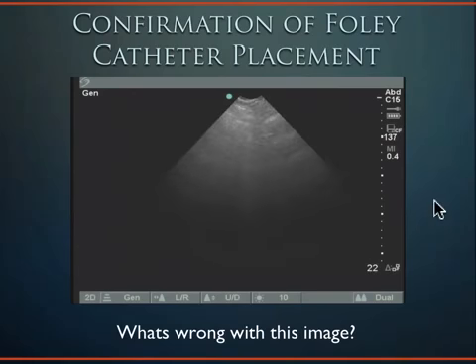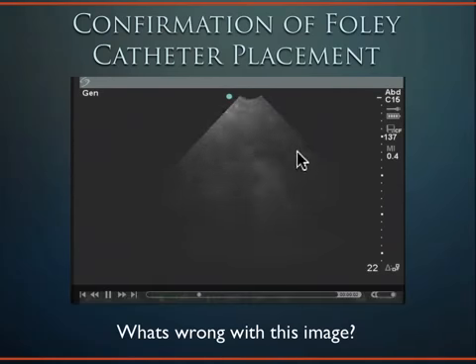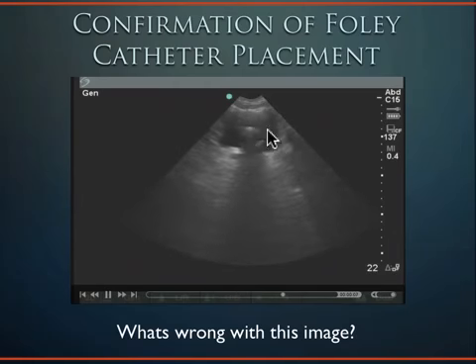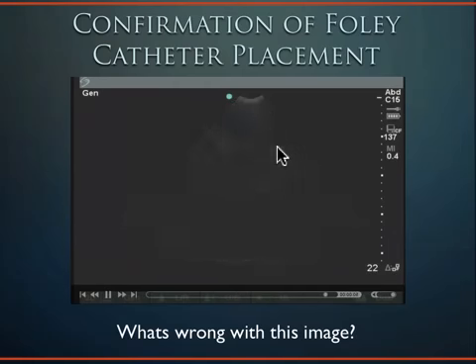Okay? Because sometimes these catheters, believe it or not, can actually get into the wrong place. The patient can pull on it, they can twist the wrong way, and the balloon starts to go into the urethra and can get blocked and all kinds of things. But this one actually has the balloon blown up inside the bladder. So the catheter is in the right spot.